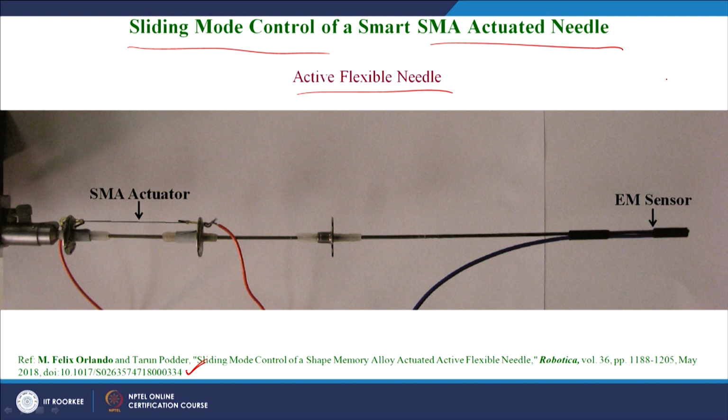This needling system is made up of an aluminum body of length 200 millimeter, and we have the disc to connect the SMA actuators.